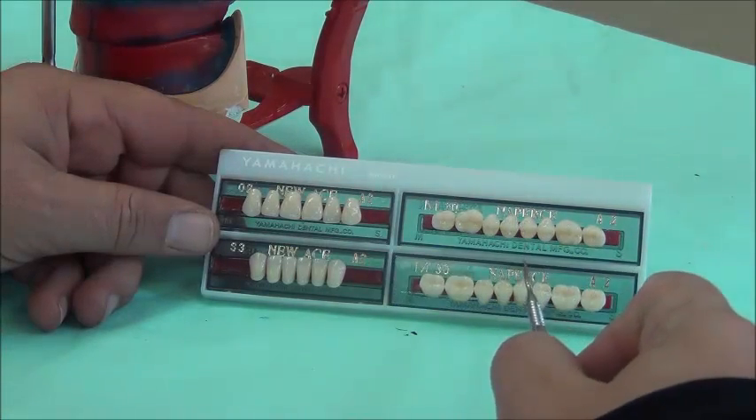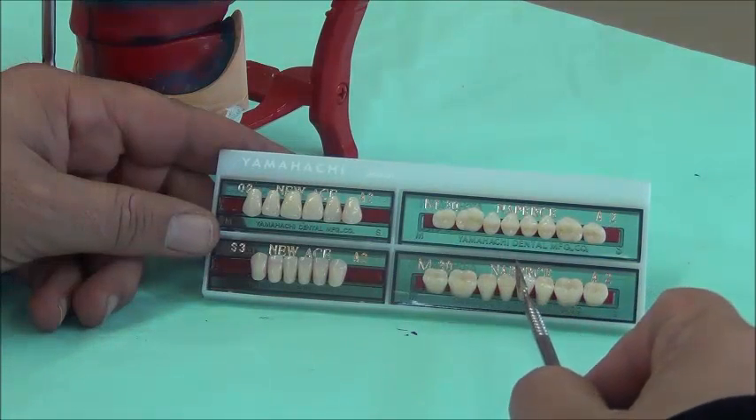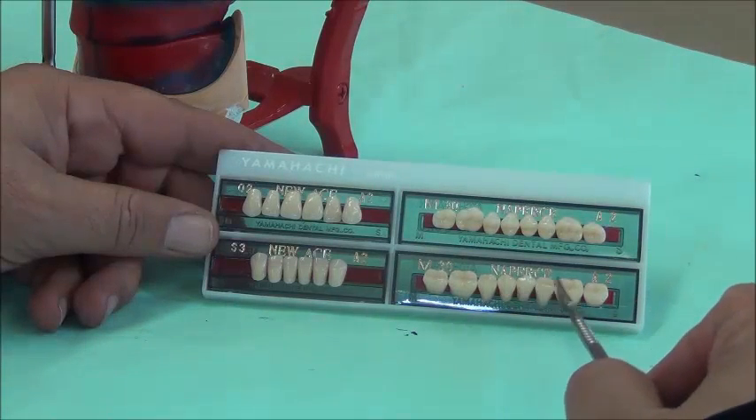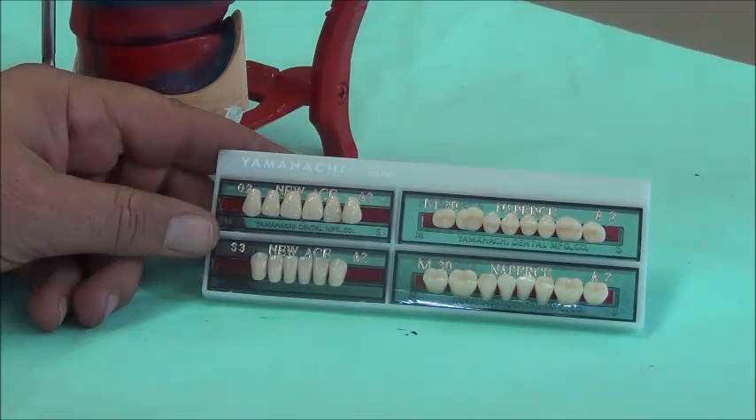The sets of teeth come with a midline, and the teeth are divided equally to the right and left of it. Remember that your right is the patient's left. Make sure you identify the morphology and left from right before setting the teeth.